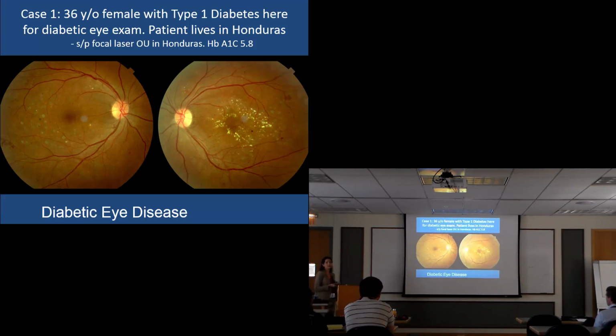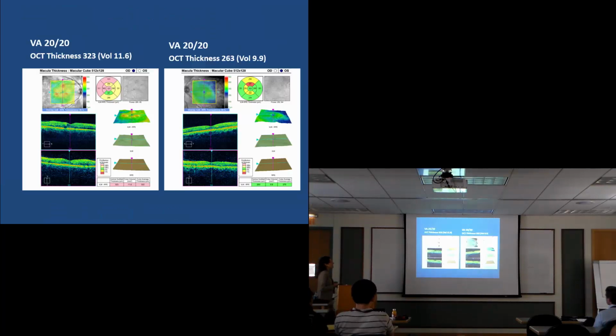Diabetes is still the number one cause of vision loss in working age adults, and really prevalent in groups of patients who have never sought out medical care. The way that it can blind you is it can collect fluid in the center of the vision and not be treated. Clinically, before OCT, this is what we had to work with, a picture. Well, is there fluid here? What's the problem? And now we can see with OCT, we can cut right through that.